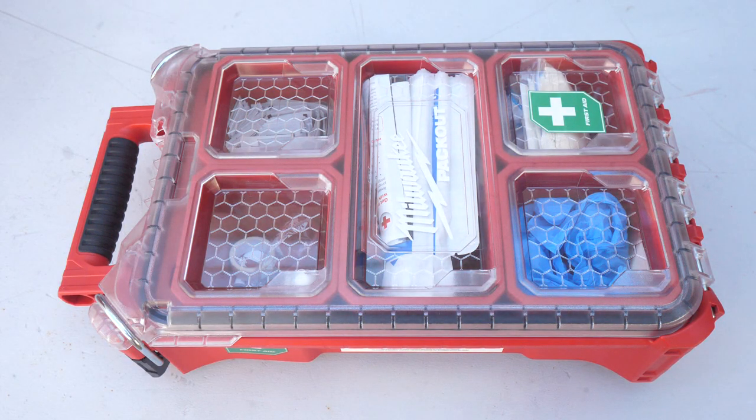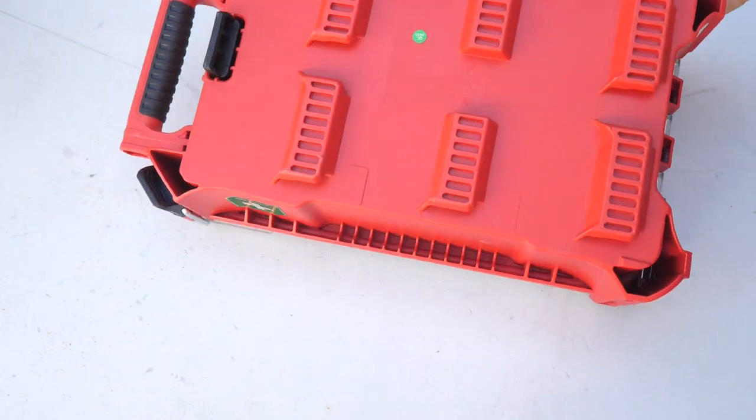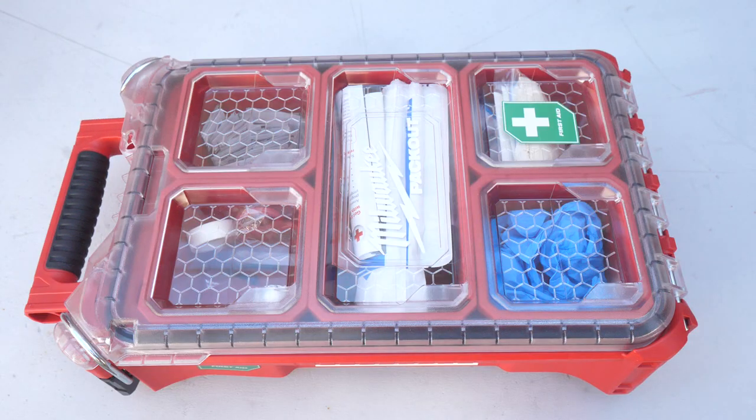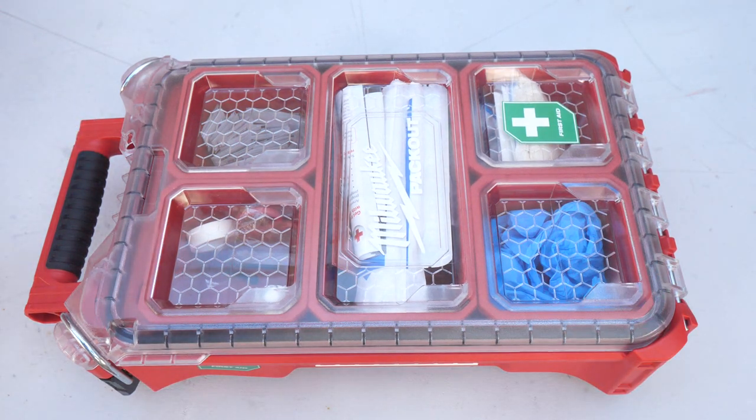Hi, this is Bill for Sparky Channel. Today I'd like to introduce you to the brand new Milwaukee Packout 76-piece first aid kit. On the backside we have the Packout notches that will slip onto any other Packout item, and we have 76 first aid supplies in here. This kit is IP65 rated.